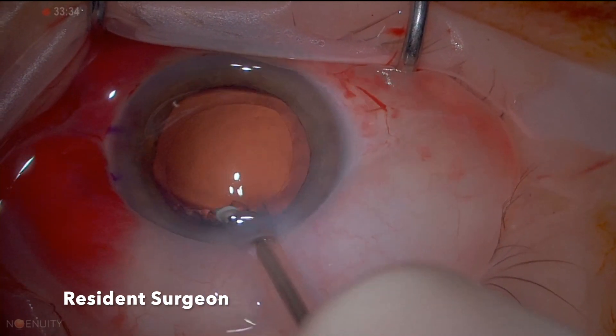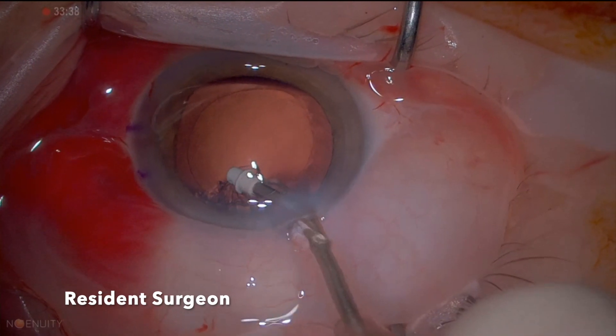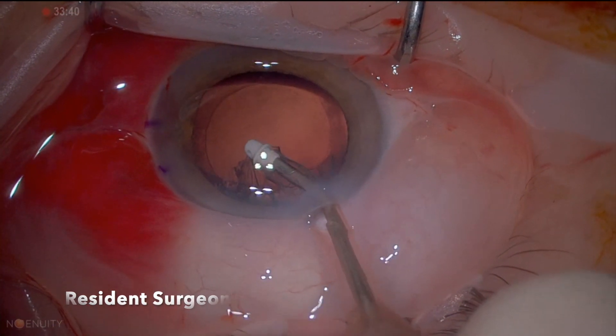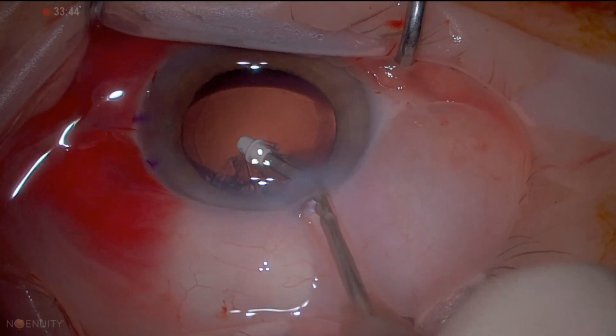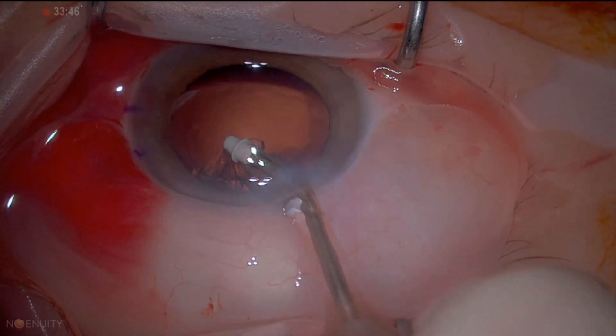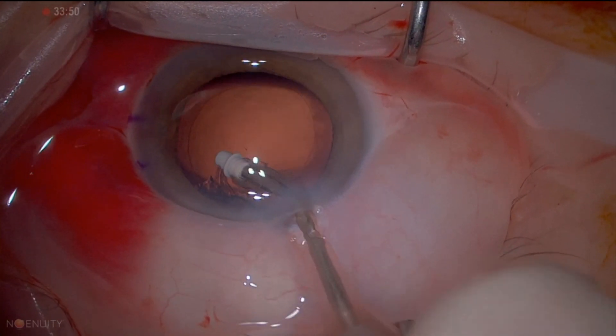The resident needs to tuck under the anterior capsule to engage the cortex. What's happening here is that the resident is tackling the cortex from the posterior aspect, and that results in aspiration of the posterior capsule, as you can see here, and capsular striae are happening, which is a dangerous situation.